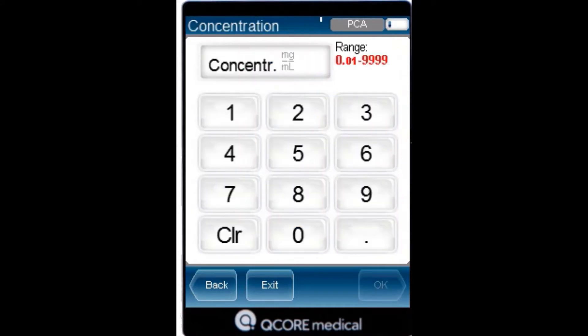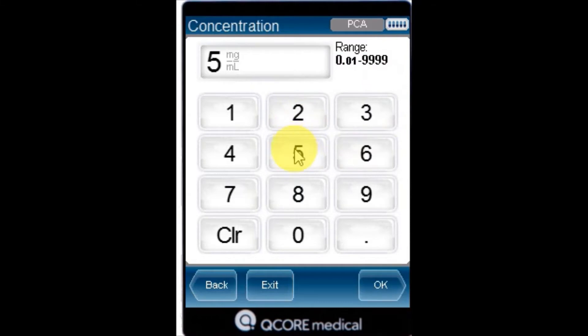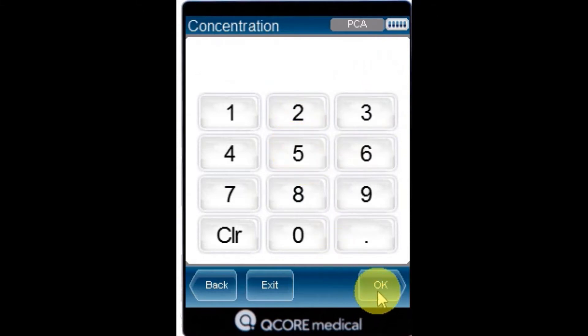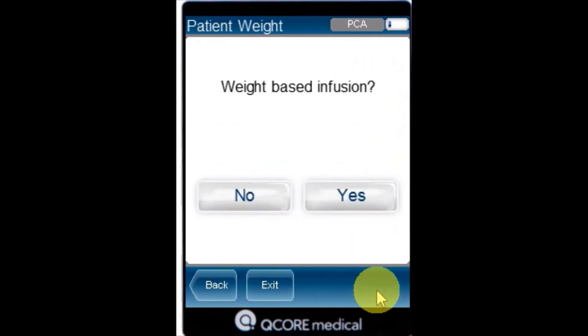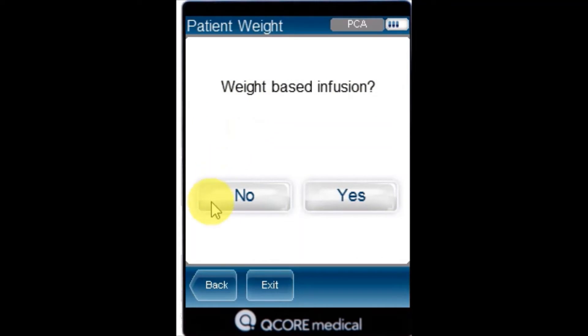From the concentration screen, using the keypad, enter the concentration and then press OK. From the attention screen, confirm the concentration and press OK.